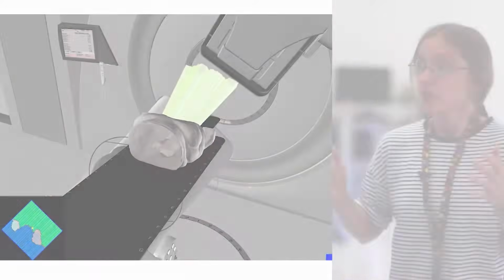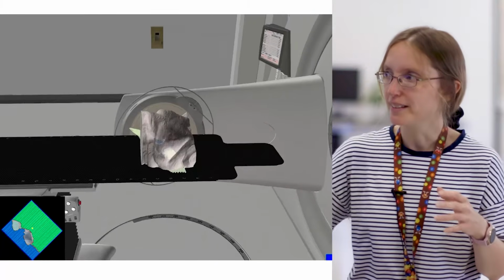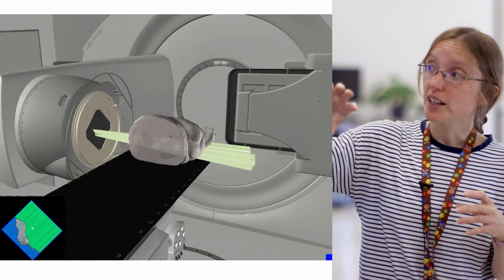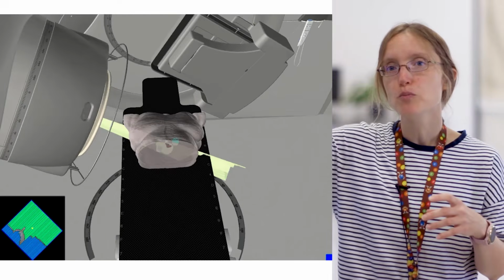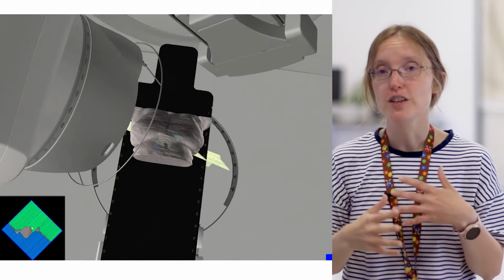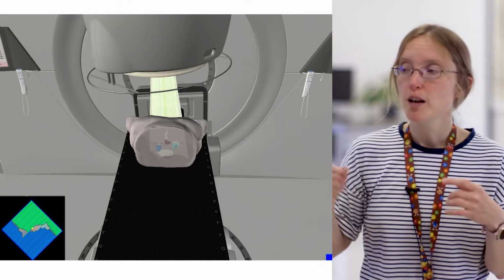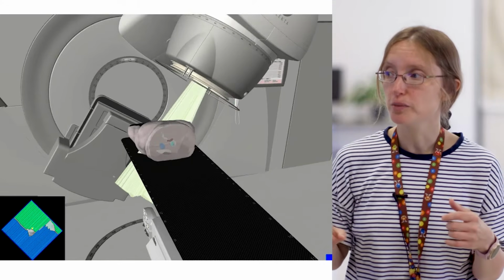Here's a mock-up of radiotherapy treatment delivery. The patient is lying on the bed. This is a patient who's got two lung tumours being treated at the same time. On this occasion, the linear accelerator is on all the time, and the machine is moving around the patient in an arc. Radiotherapy is being delivered all the time, and the beam is constantly being shaped by those leaves of tungsten that sit in the head of the machine. You can see them moving down the bottom left corner.